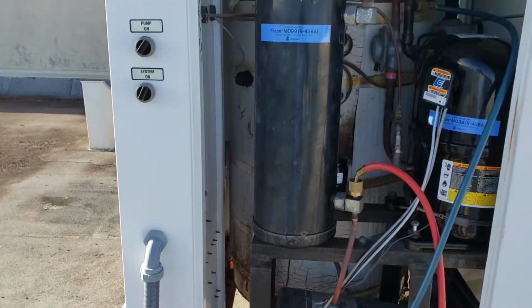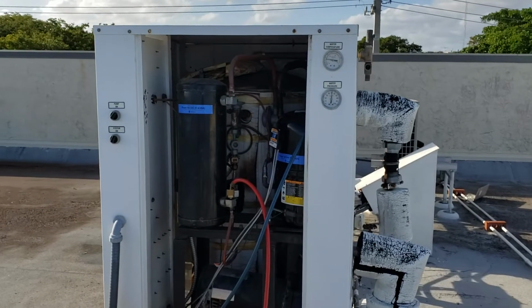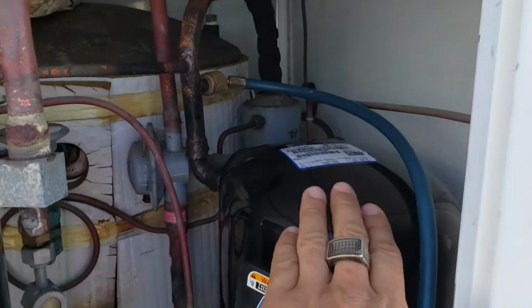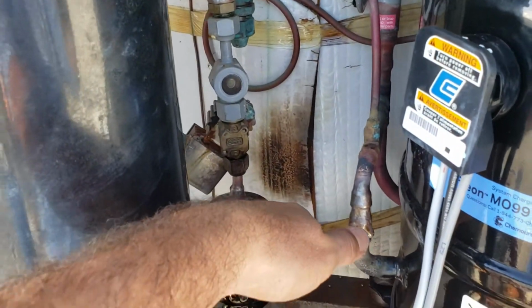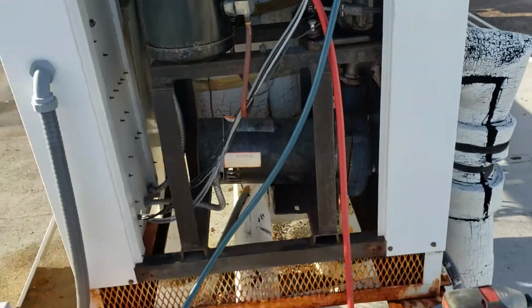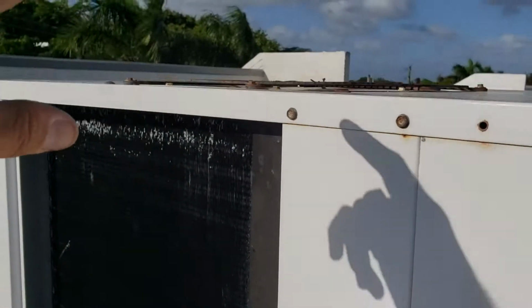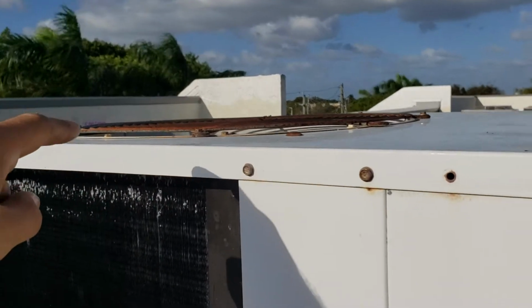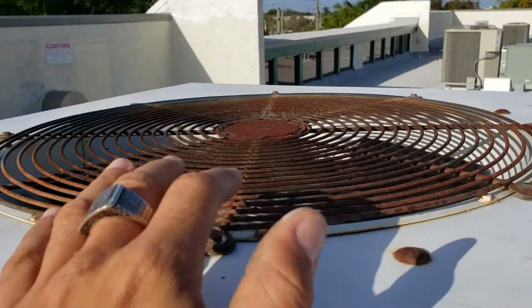Okay, real quick, this is a chiller for the MRI machine out here in Delray Beach. Right now, we just got through putting the compressor in place. The actual liquid line dryer, of course. Compressor was shorted to ground. After putting the compressor in, we also did verify. We also confirmed that the condenser fan motor was non-operational, so we got that condenser fan motor ordered and installed.